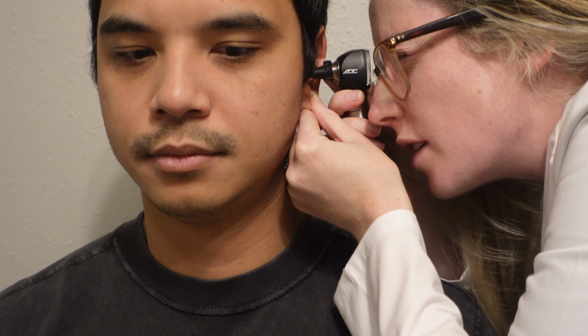Right, so I'm going to take my otoscope, pull up and back, and then just get a good visualization of the ear. I'm noting some earwax, very normal. Okay, and then I'll go to the other side. And the same thing, comparing both sides.